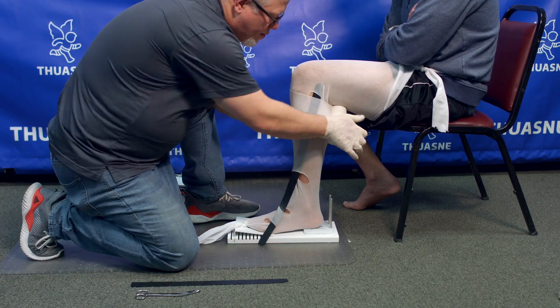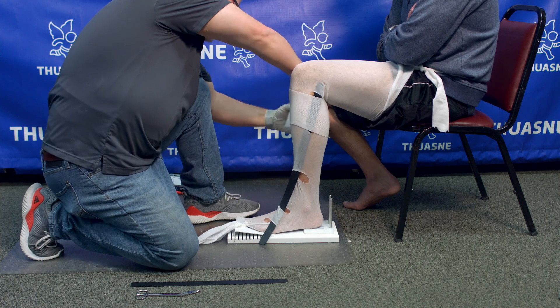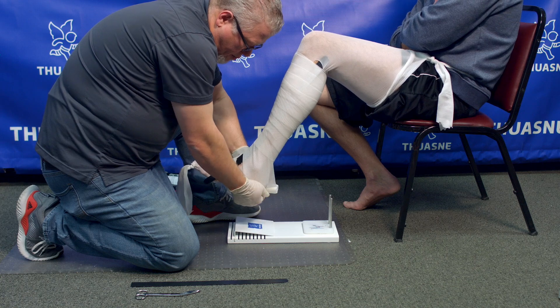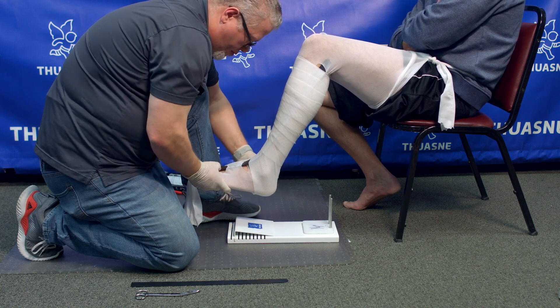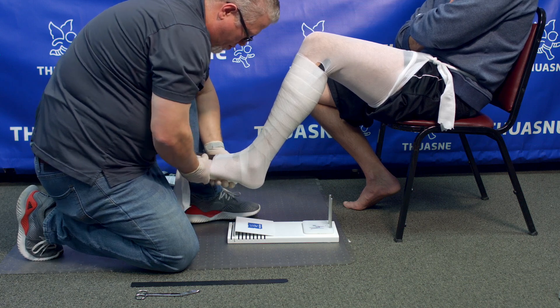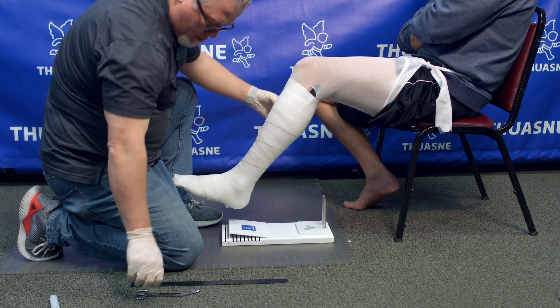Start casting the patient with fiberglass. We recommend a minimum of 3 layers of fiberglass throughout the cast, from proximal to distal end. This helps the cast maintain its geometry during shipping, handling, and filling. The cast must encompass the fibula head.